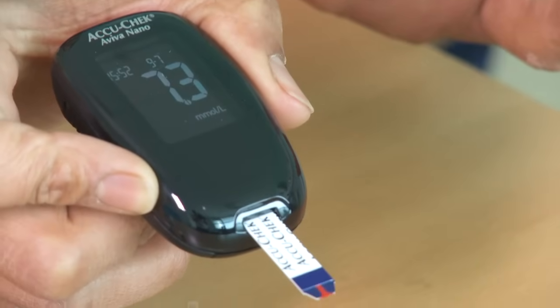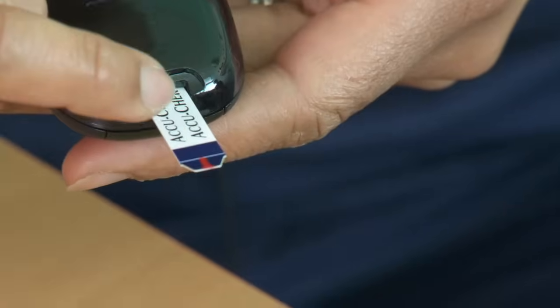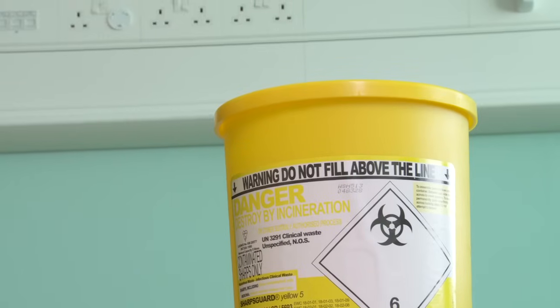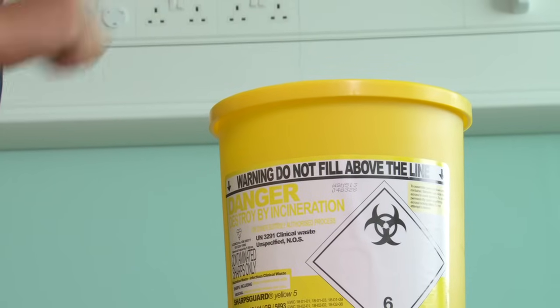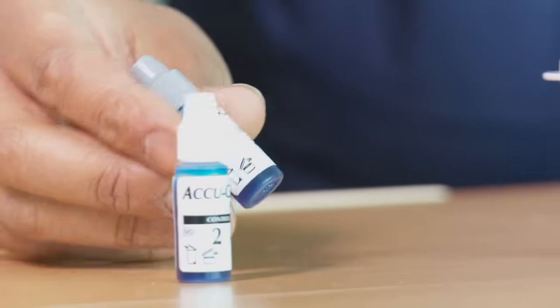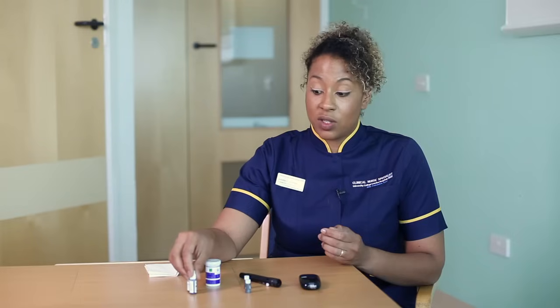Just remember to dispose of the strip properly because it has got blood on it — put that in the sharps bin. Thinking about keeping your meter in good working order, make sure that once a month you use control solution, which you can get from the company and the instructions will come with it. And always make sure that you keep your fingers clean.